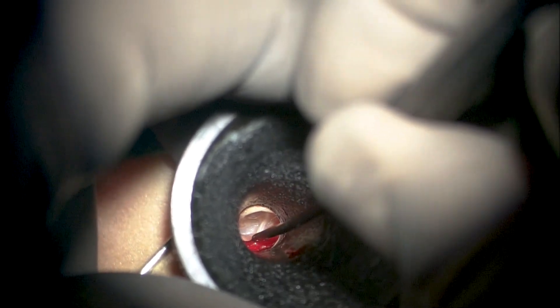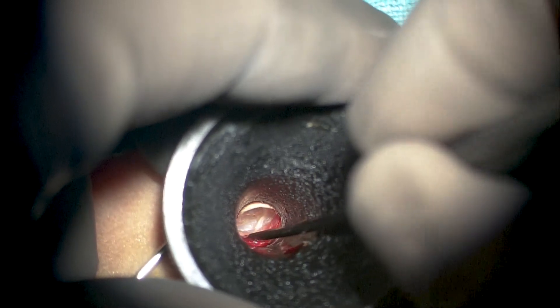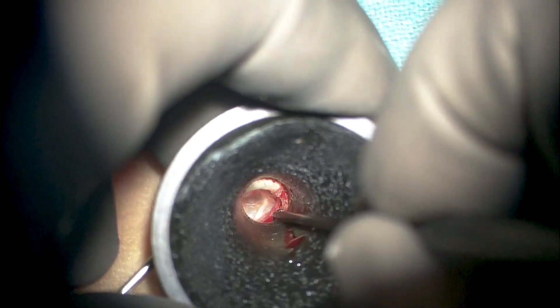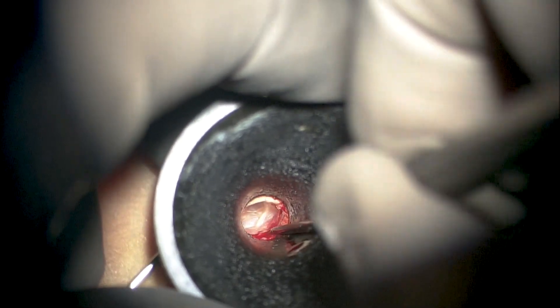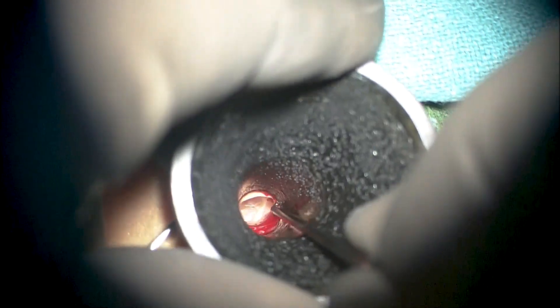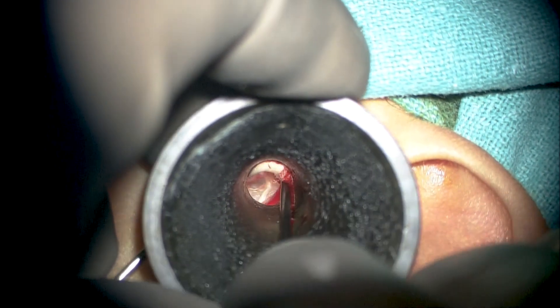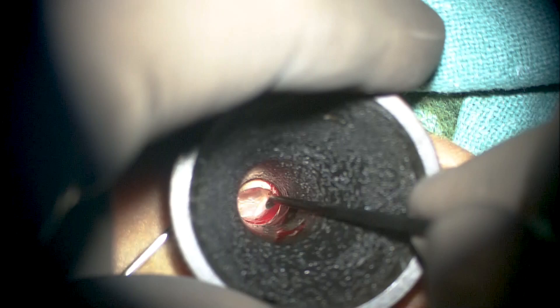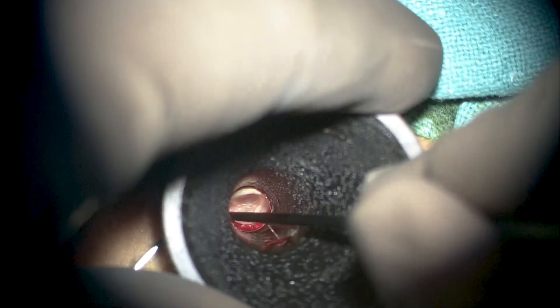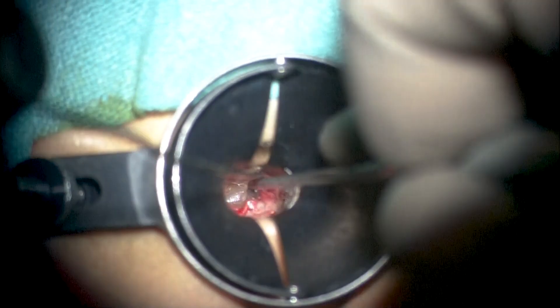This video demonstrates the trans-canal excision of a posterior superior retraction pocket in a pediatric patient with minimal to mild conductive hearing loss. This retraction pocket has been under follow-up for the past one to one-and-a-half years. Once it was noted to be progressive after multiple visits, with irreversible contact with the incus long process and the chorda tympani but with the fundus still visible, a decision to operate was taken, given that the opposite ear had already undergone a modified radical mastoidectomy and displays a reasonably high amount of conductive hearing loss.